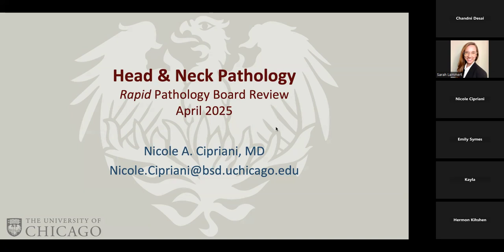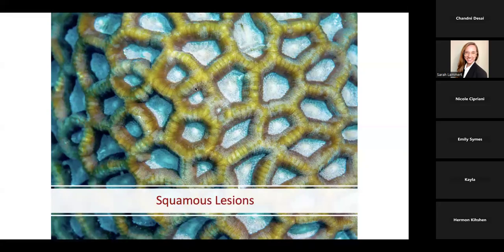All right, so all of head and neck pathology in an hour. We're going to do it. So we're going to start with squamous lesions because that's probably one of the most common.